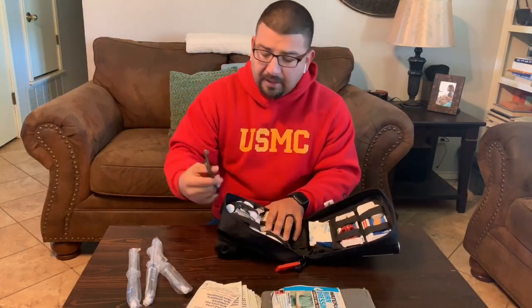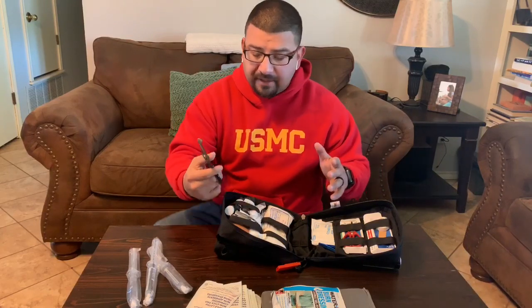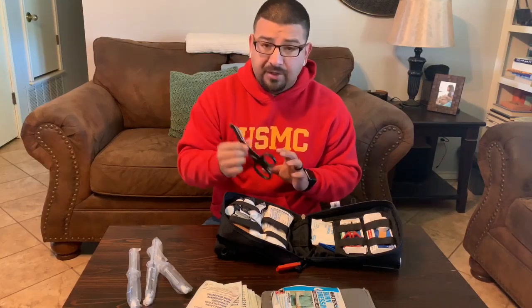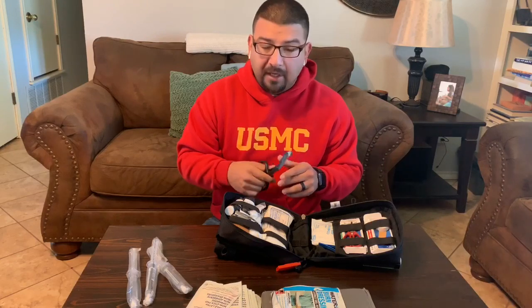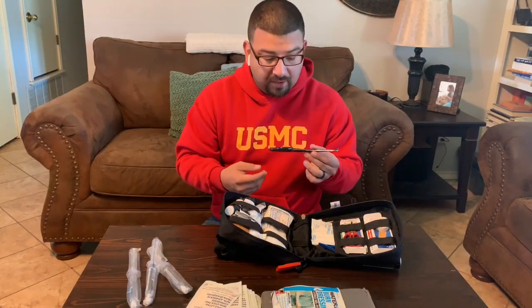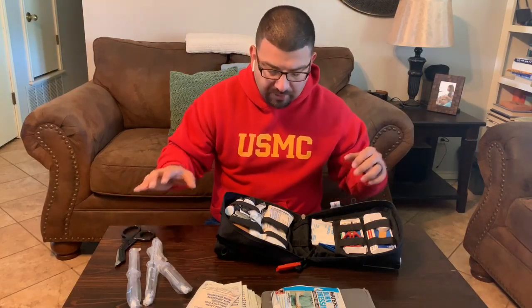The next thing, every medical bag should have this, are trauma shears. And these aren't anything fancy. I think they're a $10, $15 pair of shears. They definitely do work. I can cut through a penny with these things. That was kind of like my test. If they can cut a penny, then they'll work, and they've worked thus far. I've only had to use them maybe twice, and I've had no issues.